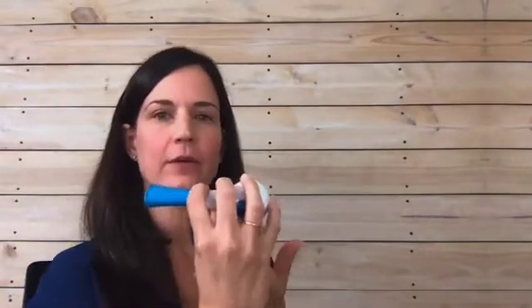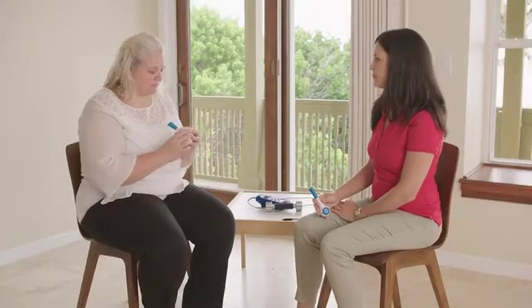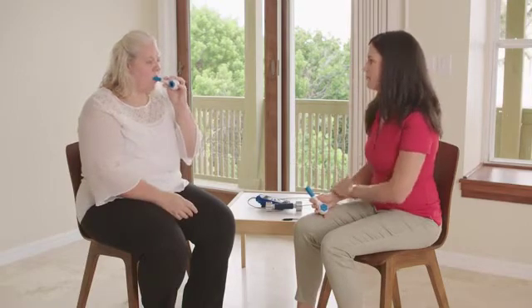Now it's time to try your Breather. You'll see there are places to put your fingers so that you can hold your Breather without impeding the airflow. I'm going to guide Wendy in her first try, and I invite you to try right along with her. Place the mouthpiece in your mouth. Try not to clench it with your teeth — I don't want you to tense up your jaw. Now breathe in through the mouthpiece, hold, and breathe out through the mouthpiece. Do you hear the wind sound? That wind sound means you're working those muscles of respiration at a therapeutic level.